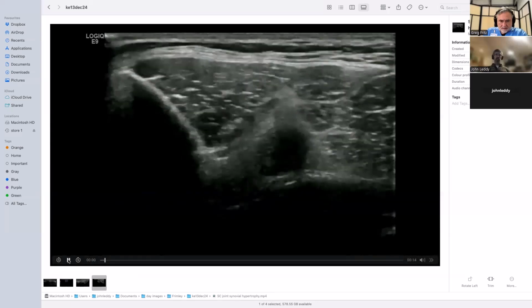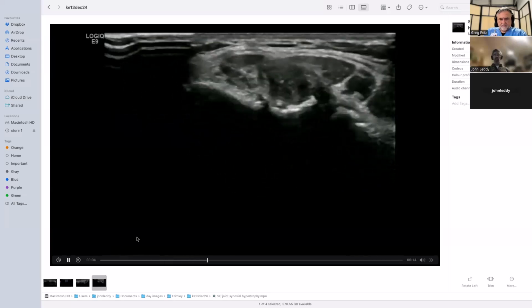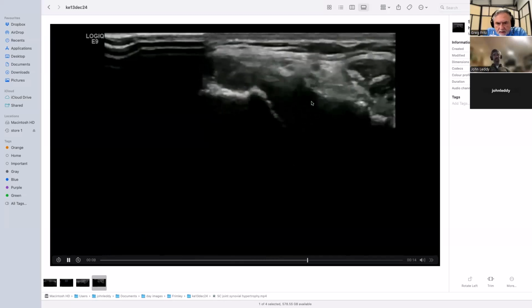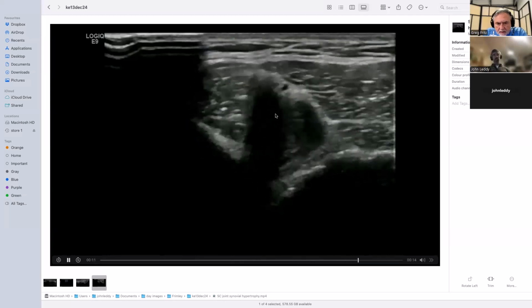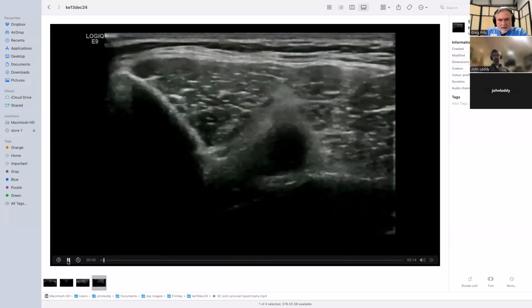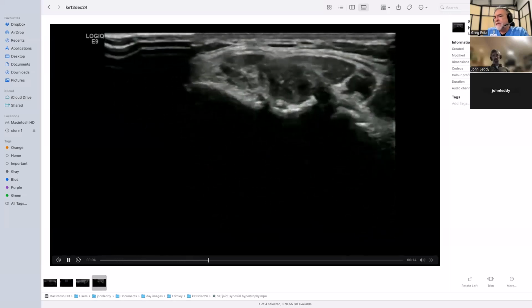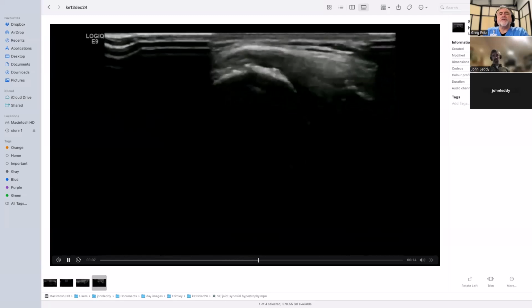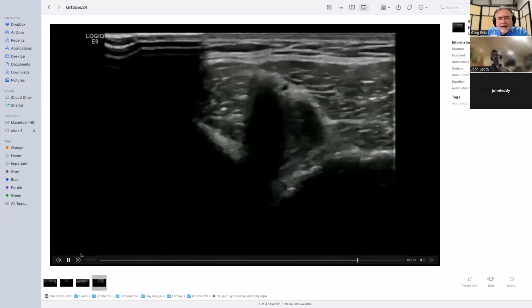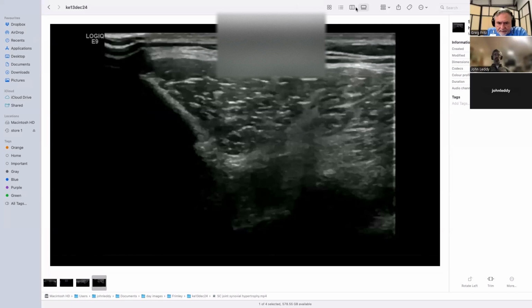And this is a little bit slightly unusual. This is a sternoclavicular joint, and just a little bit of swelling around the joint, which isn't very uncommon, but this is synovitis around the margins of the joint. Do you scan this as a component of your shoulder scans, or because the person came in saying, I have pain here? They come in with swelling. All right, the shoulder.